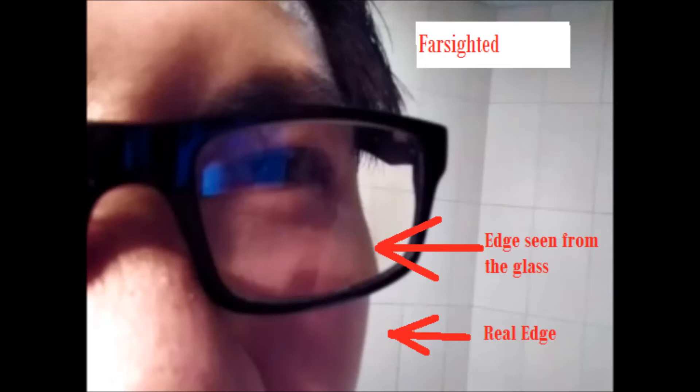On the other hand, a farsighted glass makes the face of the patient bigger. If you compare the normal edge to the edge visible through the frame, it bulges, or becomes bigger.